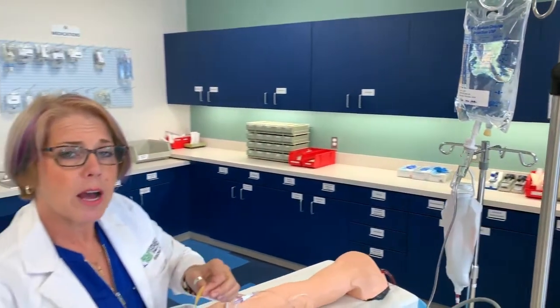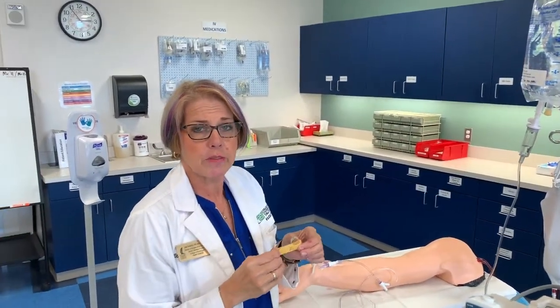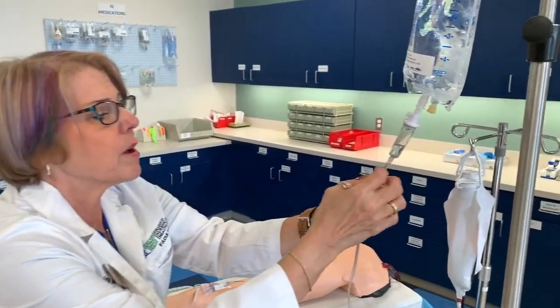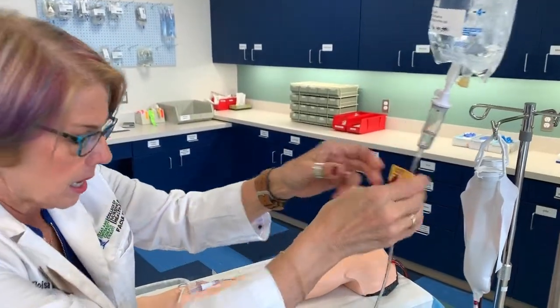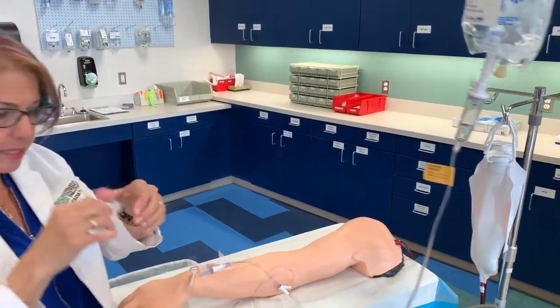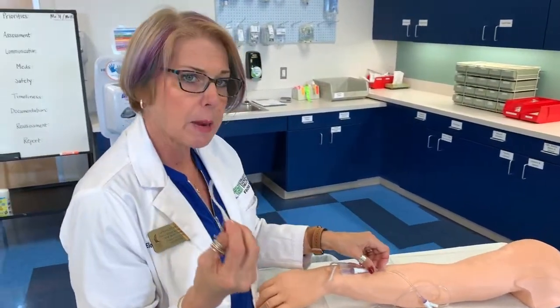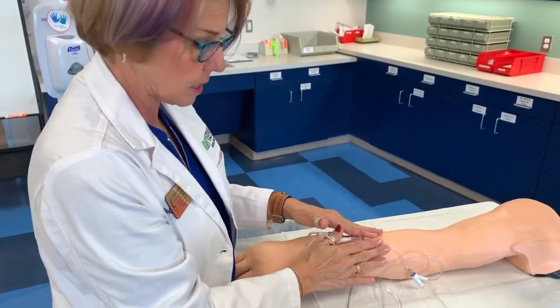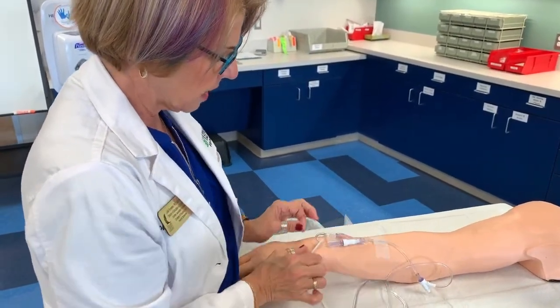In Islander Regional Hospital, our primary tubing is good for 72 hours. So I've got my Change Friday sticker that I'm going to go ahead and label my tubing with. Last but not least, I'm going to take my piece of tape. I personally like to use paper tape because it sticks really well to patients, but not their skin. And so I've secured my IV line.